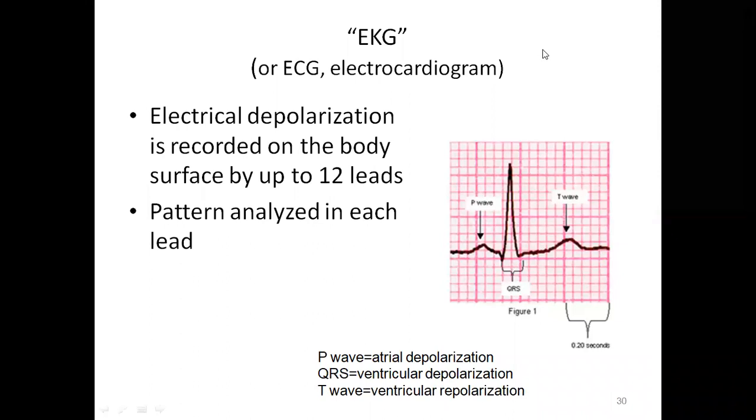You must have heard that if a person has a heart attack or some complication of the heart, the doctor advises going for an ECG, where we get a long graphical representation of different waves. That tells the proper functioning of the heart muscles. And if there is some alteration in the waves, we go for the treatment.